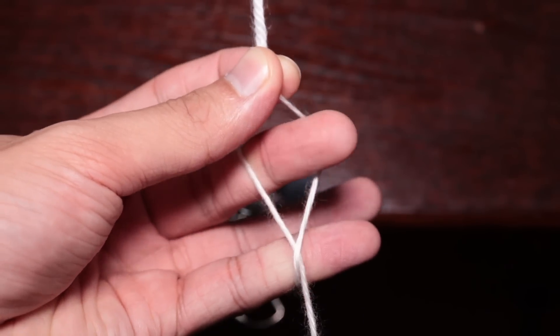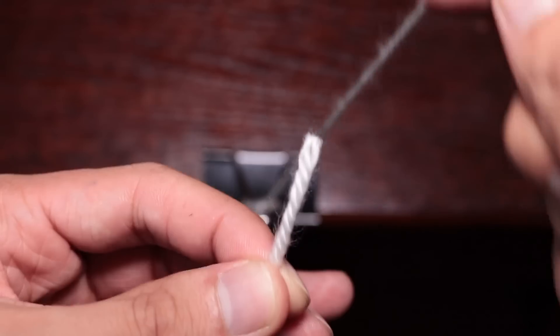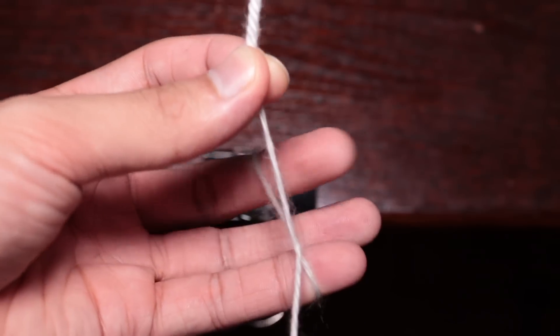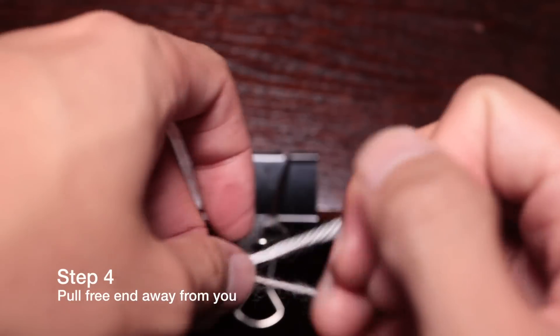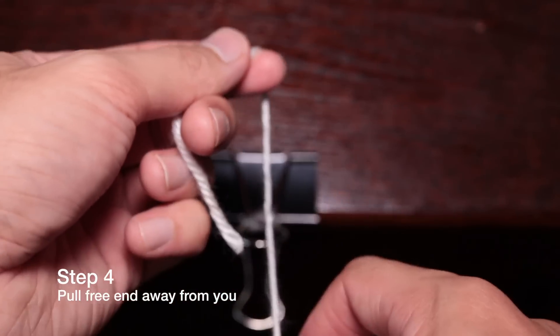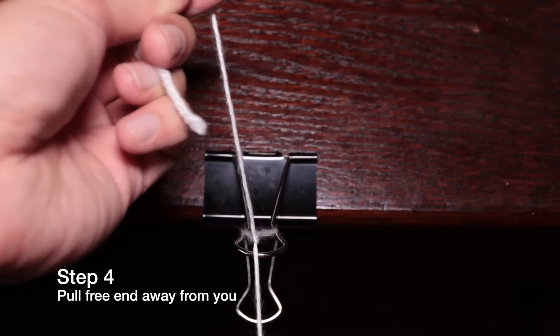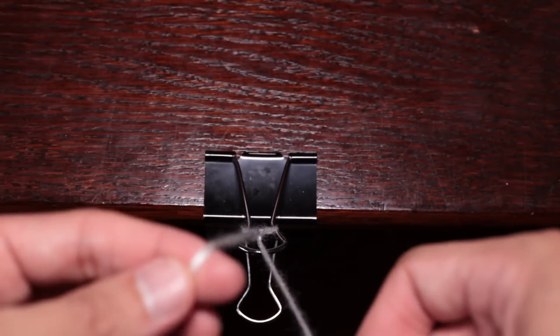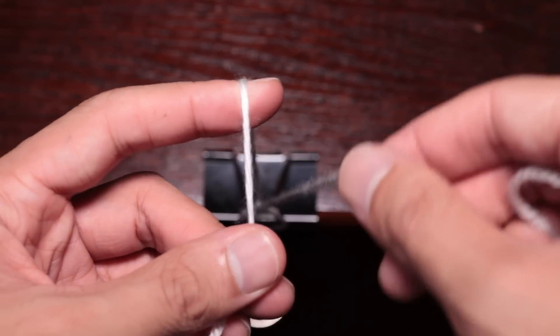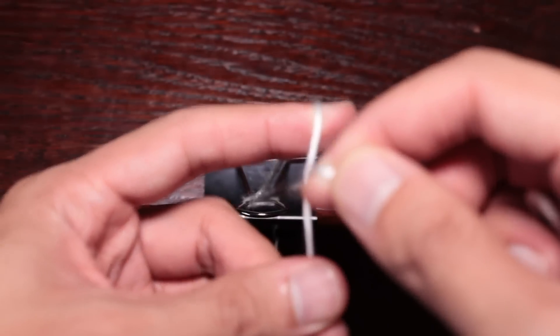Then you're just going to pull it through just like you did in the first knot, pull it through with your middle finger and away from you. When you're doing the middle finger knot you're always going to pull the free end away from you and then you're back in the initial position to do the index knot.